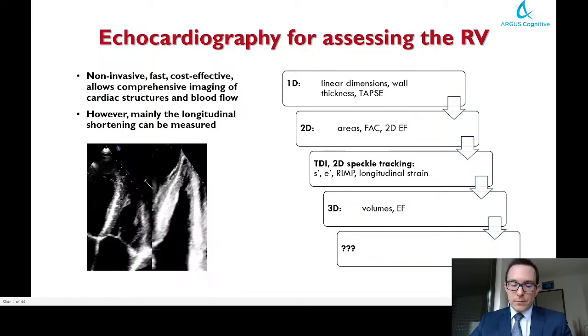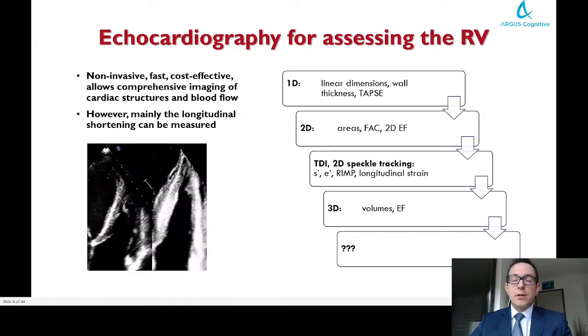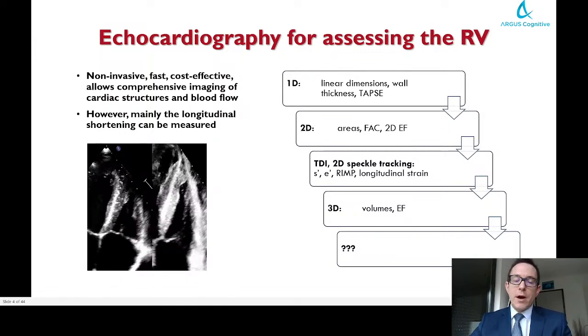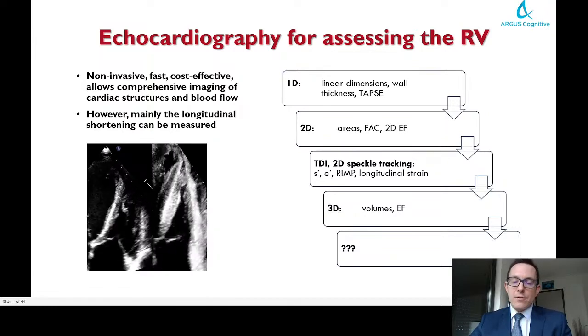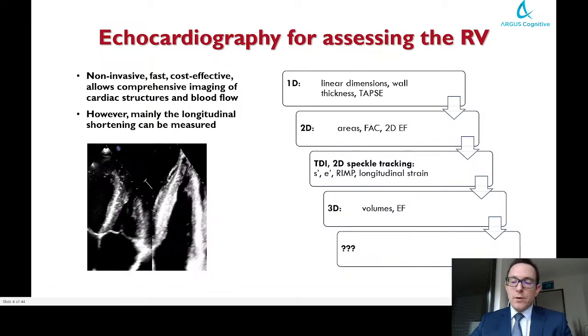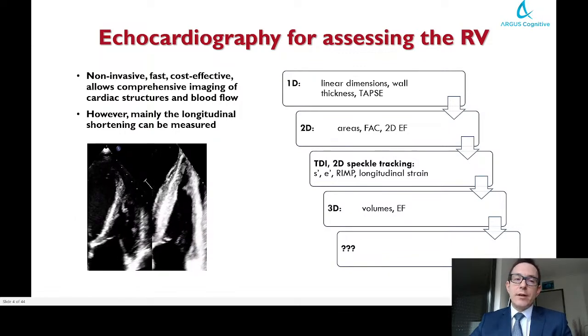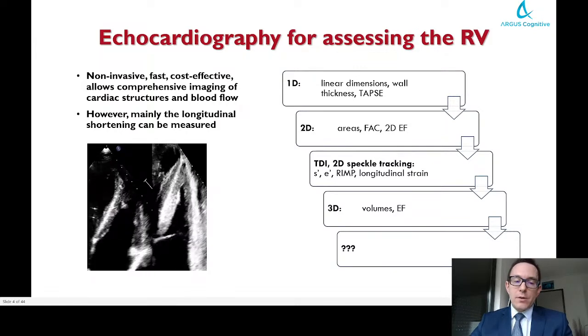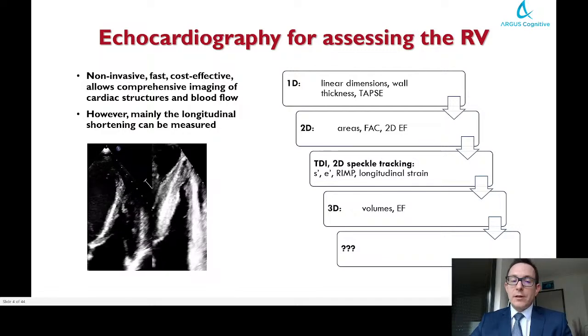The idea and the development efforts started with heart transplanted patients coming from my clinical practice, where I would like to have a quantitative method to assess the non-longitudinal mechanical pattern, to assess and quantify radial RV motion, to understand what's happening in different clinical scenarios.